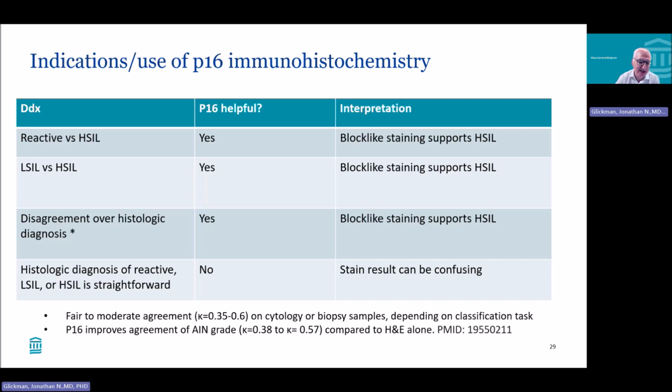But if the histologic diagnosis of reactive, LSIL or HSIL is straightforward, I don't think there's much call for a P16, because the stain result could be potentially confusing.